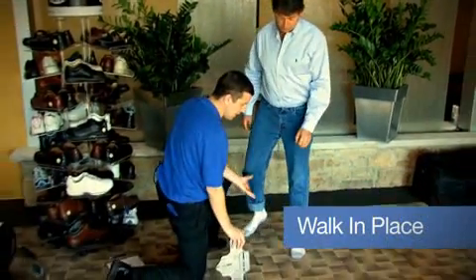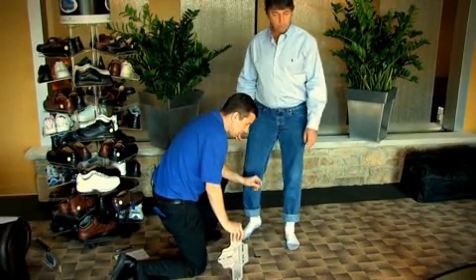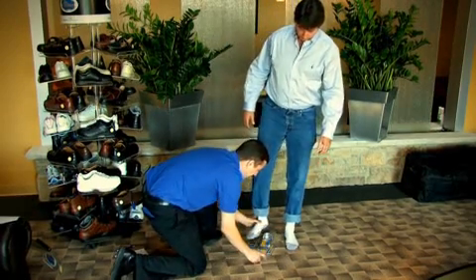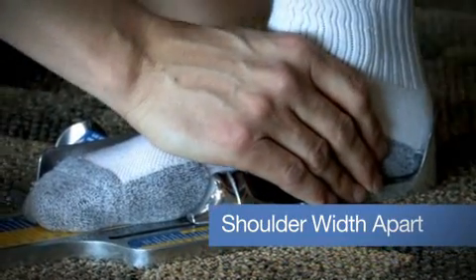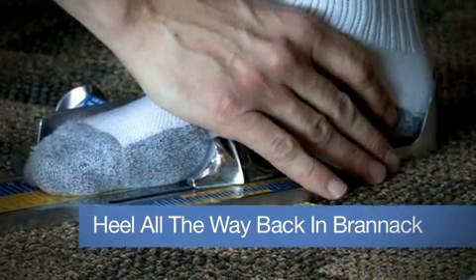This is perfect for him to walk in place, so we could get him in his most natural setting. Once we do that, we're going to put the right heel back first. Get his feet shoulder width apart. Once they're shoulder width apart, we'll make sure his heel is securely back in the heel cup of this Brannock. I can do that by grabbing his instep.